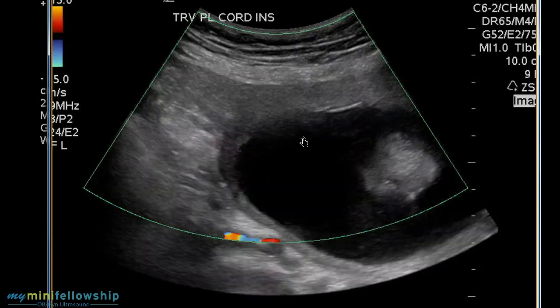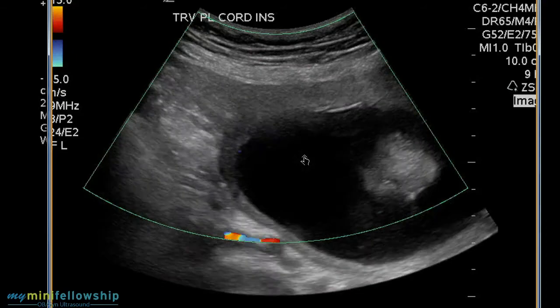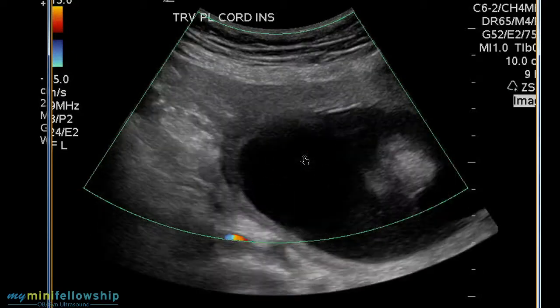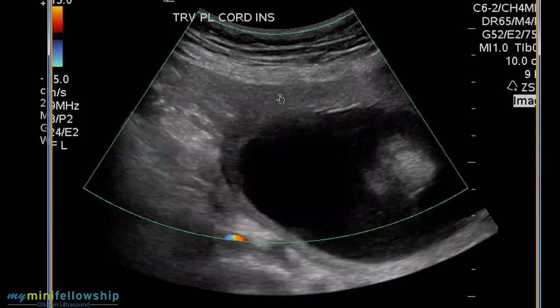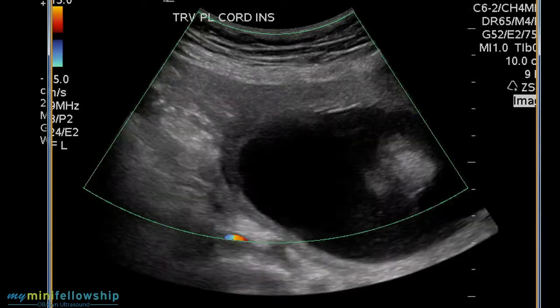Yes. They should. What about a peripheral cord insertion? Yes. Basically, these issues are more important in monochorionic twins than they are in singletons. But the obstetrician will make the determinations about follow-up for growth. But you can pretty well rest assured you'll be seeing the patient on more than one occasion if you identify this abnormality. And also a peripheral cord, not a Velamentous, but peripheral. Just say it's inserting way out here on the edge of the placenta. Again, I think you will find that the obstetricians will tend to follow those patients more closely.